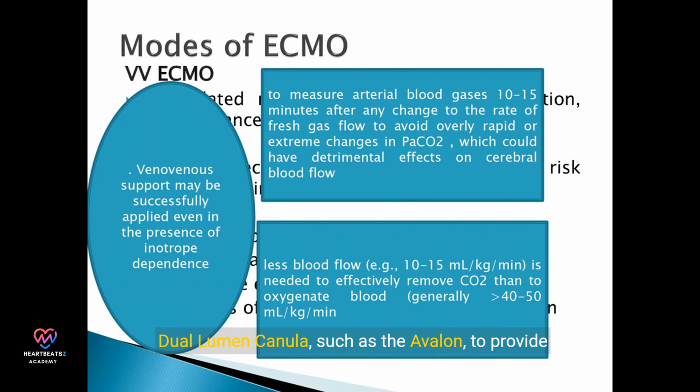In conclusion, ECMO is a vital tool in critical care, providing life-saving support to patients with severe cardiac and respiratory failure.